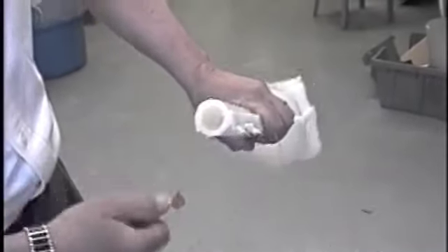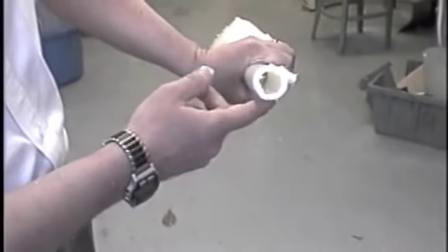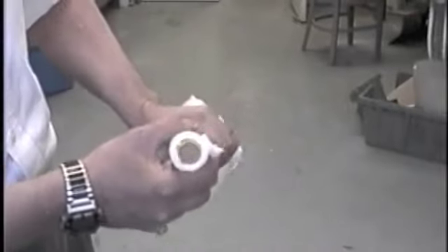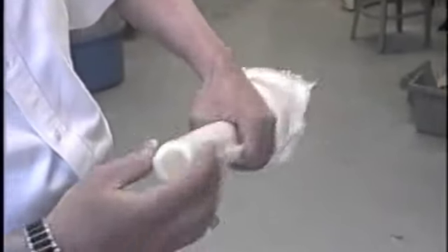Another thing you want to examine at this point is the thickness of the pylon wall. Now, there's always certain deviations in thermoforming. Let's face it, we're not working with thousandths of an inch. But if you look at that pylon wall, it should be uniform thickness all the way around. If you see it too thin on the posterior side, something's wrong. Usually what happens is you're not following the forming template pattern, where the material is too heavy, so it's drawing down, and you're thinning out the plastic before you get your vacuum. Okay.